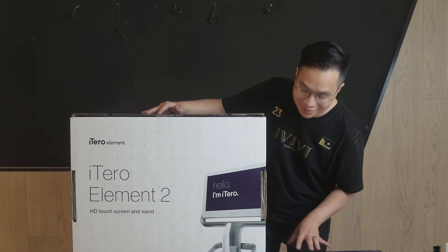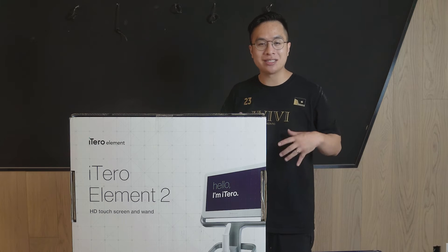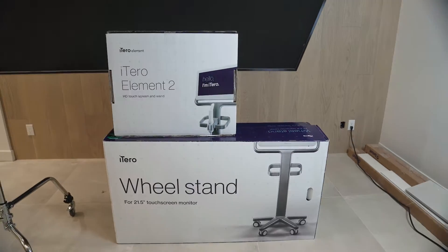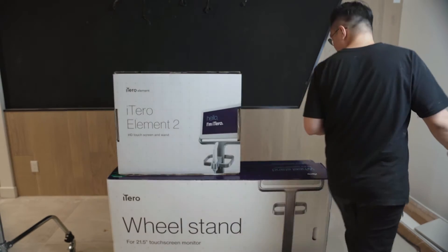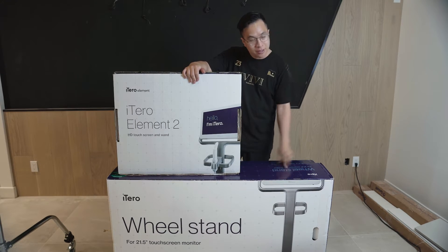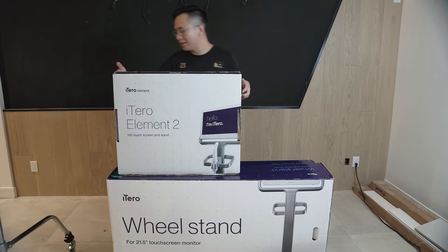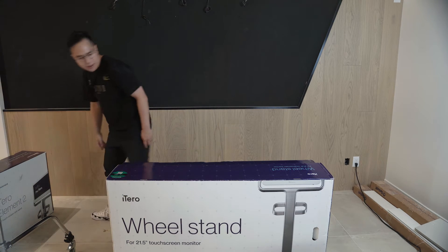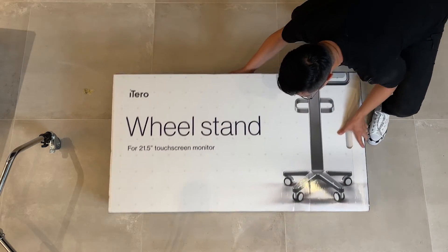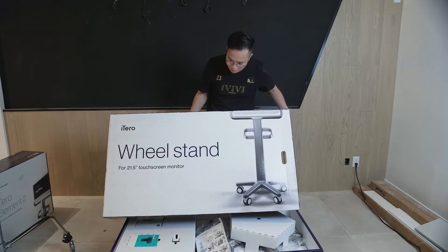I'm going to zoom out so you can see the big picture and all the components involved. There are two boxes — the smaller box has the touch screen and the wand, and then the bigger box has the wheel stand that the wand and touch screen sits on. Let's move the touch screen box to the side, and then let's put this up — it's actually pretty heavy.